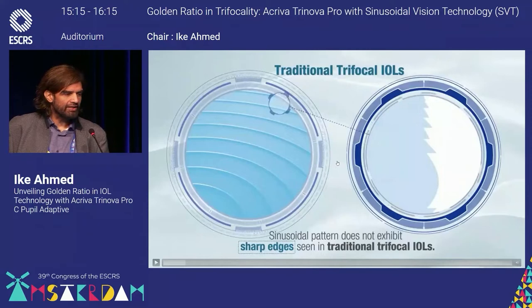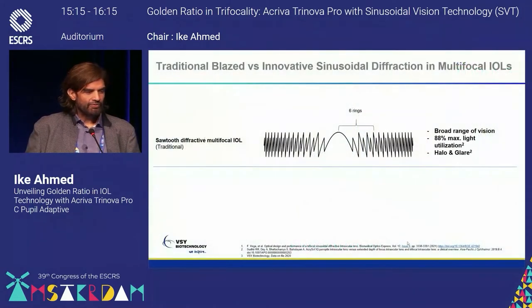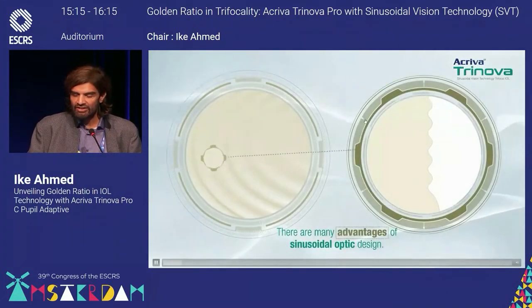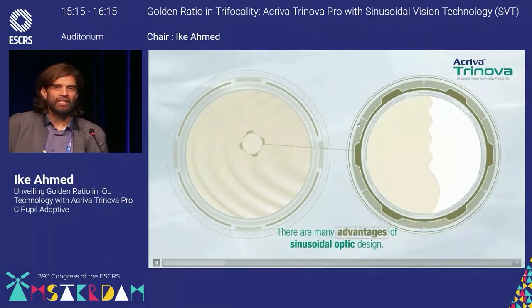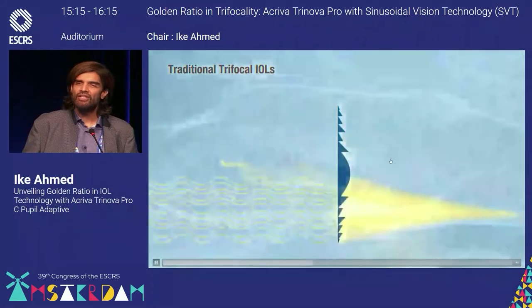in the sinusoidal gradient, can I get the next slide, please? I think I'm stuck on there. Here we go. Oh, back one slide. If you look at the previous slide here, you can see that the diffractive grading is very different. The smooth surfaces are identified on the surface of the optic here, you can see. And this is different than the sharp edges.